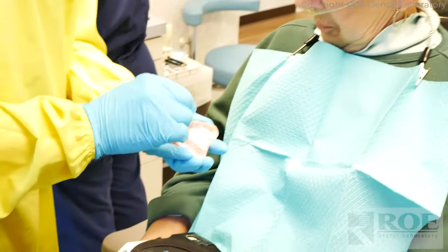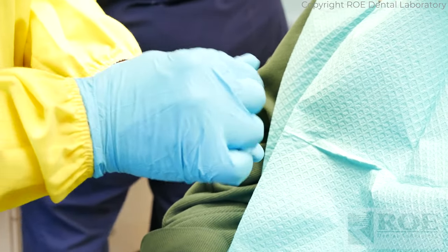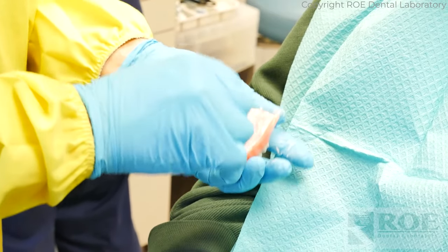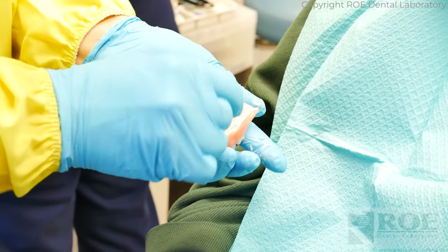So before the sore spots appear, we're going to catch them. Does that mean it's going to remove all the sore spots? We hope so. You might still have one sore spot, and you'll call us and we'll get you in and adjust it for you.